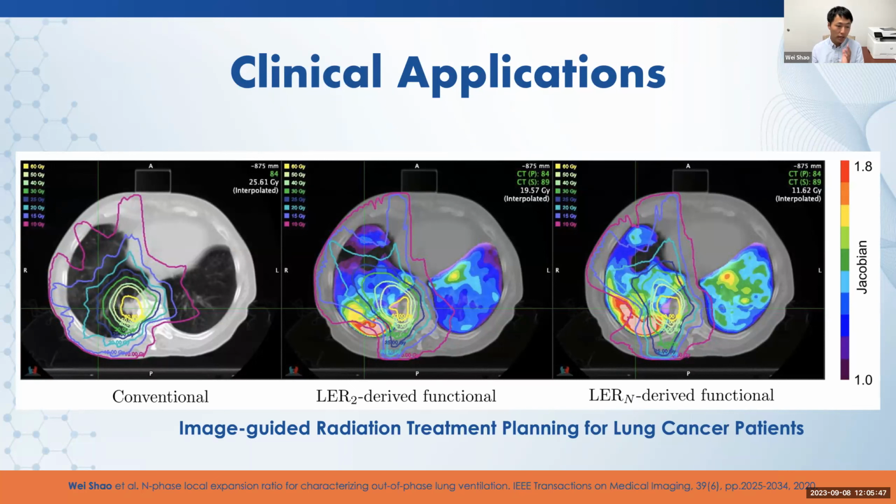By image registration, I can align those time series of CT images into the same coordinate system, and then I can obtain a deformation of the lung with respect to time, so I can keep track of the motion of the lung, which can be used for treatment planning.